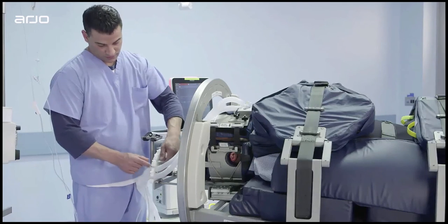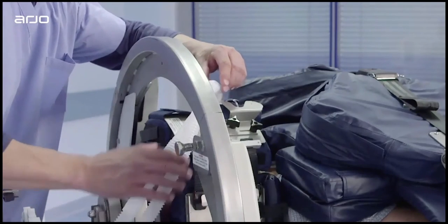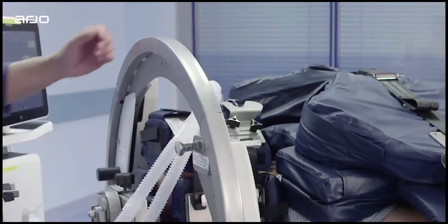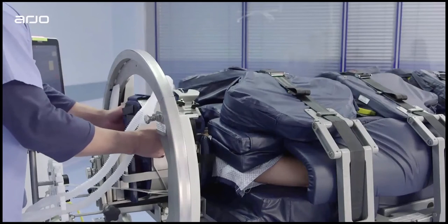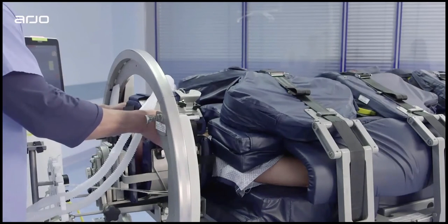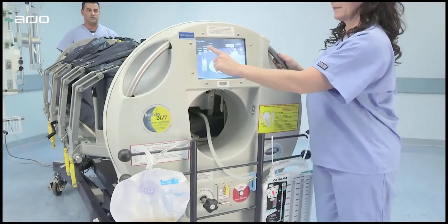Second, examine the patient's airway. Ensure the endotracheal tube, ET tube, and the ventilator tubing are secure and have adequate slack to avoid pulling or twisting during a full rotation. Once the airway is assessed to be adequately secure, press the Check Airway button.